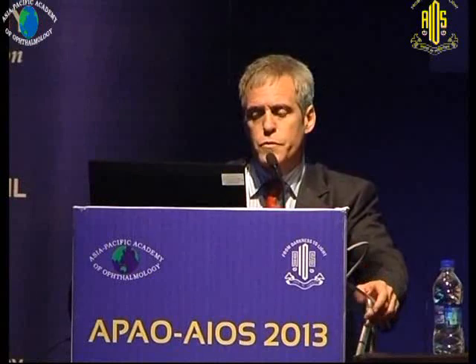Anterior infusion, coaxial, would be what most anterior segment surgeons would use, and it has the advantage of gentle flow, but the disadvantage is that you can sit there for a long time continually bringing vitreous up into the anterior wound. You can consider a Lewicky, but keep in mind that if you have that on with full flow, you will have turbulent flow and push nuclear material into the posterior segment. But a Lewicky self-retaining anterior chamber infusion line is an excellent way of entering an eye that has choroidals, and you can use this to start your procedure as a retinal surgeon and then swap over to pars plana insertion of infusion.